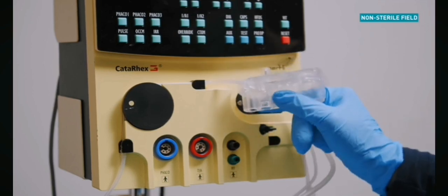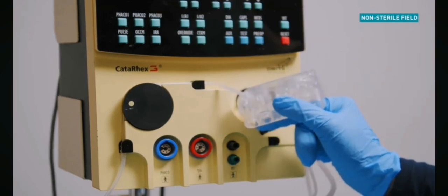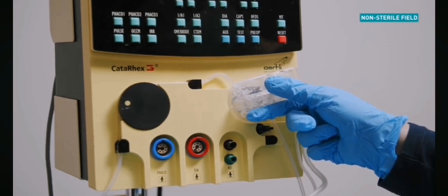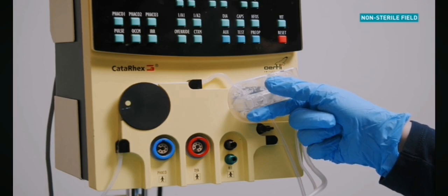Now connect the cassette. Ensure that the guide pin on the back of the cassette lines up with the port on the cassette slot. Holding the cassette at a 45 degree angle, clip the cassette into the locking pins located on the cassette slot. Press the cassette flush against the device.